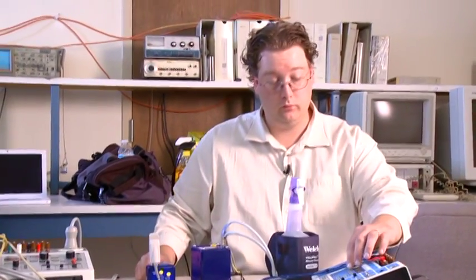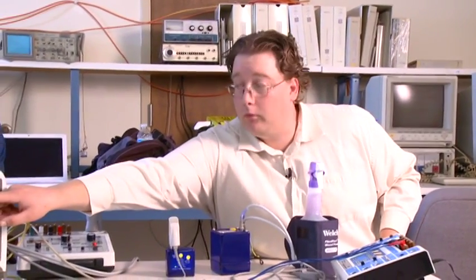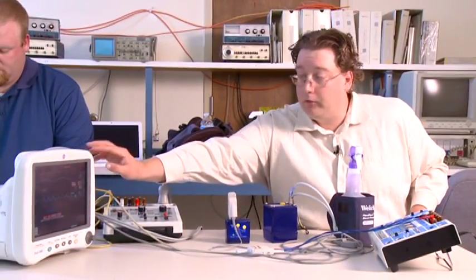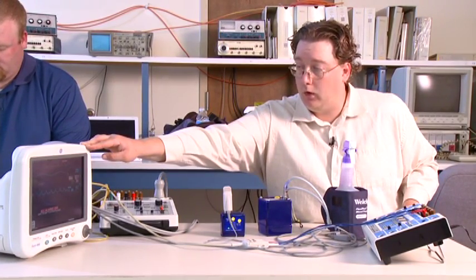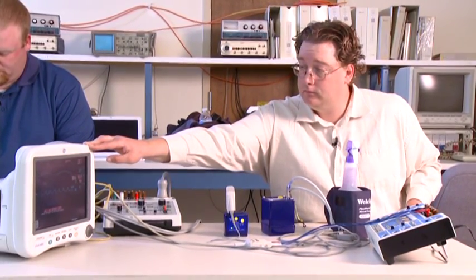Then we're going to reduce our heart rate down to 30 beats per minute. And it'll take a little bit of time for it to pick up. You can see the peaks of the waveform are starting to spread out more, and it's reducing. And you can also see that we've got an alarm flashing here, and this is flashing red. The alarm reads bradycardia, which indicates a low heart rate condition. And we can see we're sitting at 29, 31. We're bouncing back and forth a little bit. Joby, if you could record 29.